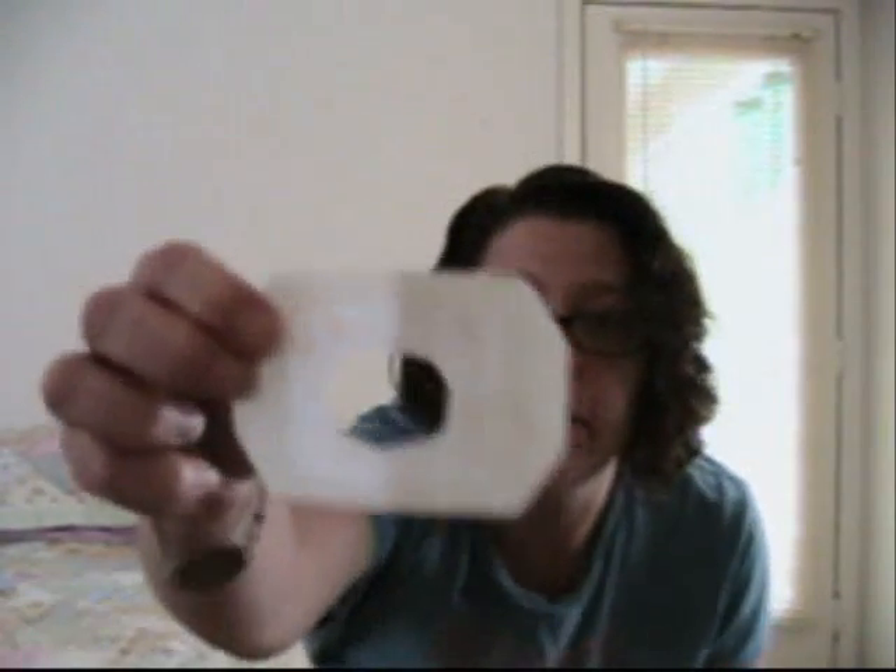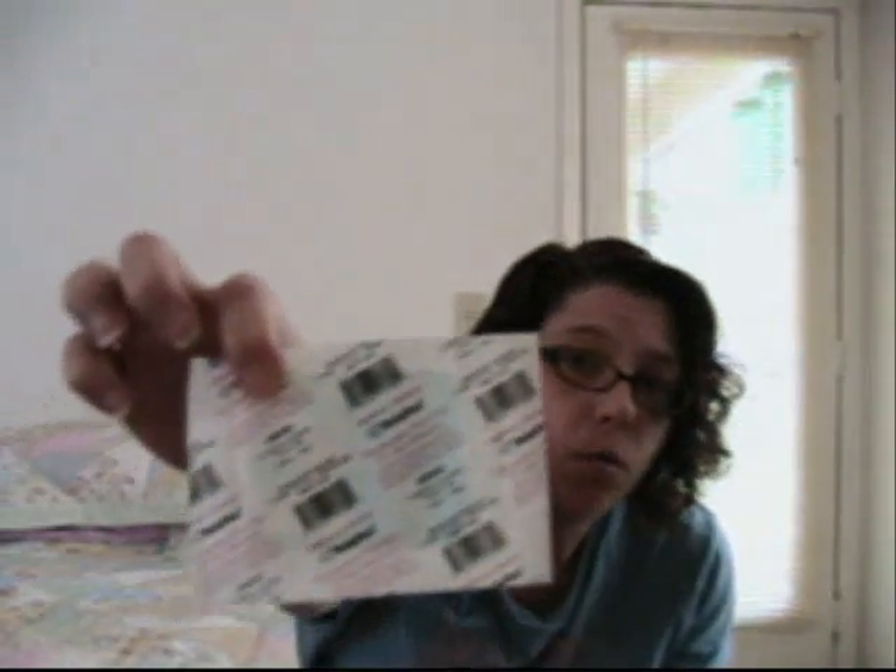So what are some of your options as far as products to use when you want to tape down a sensor or an infusion set? You can use IV 3000 — I have one already cut so you can see you just stick it right over the infusion set. There's also Reliomed, which is a great option. Both of these products are usually used for IVs at the hospital, so they're a thin clear film.